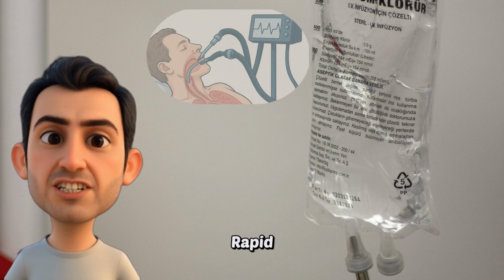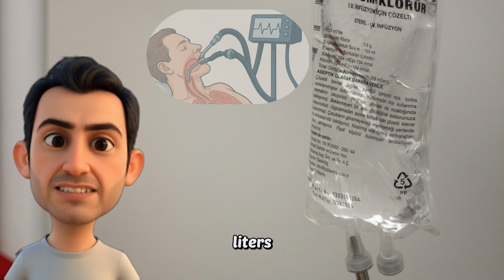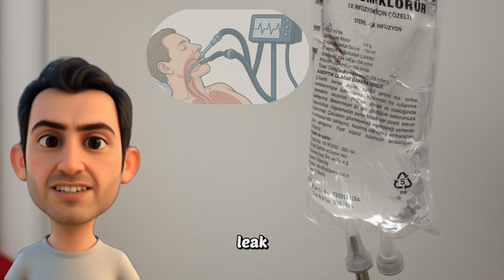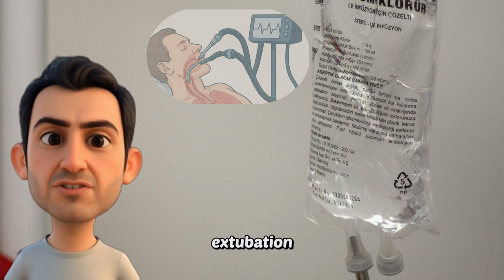Then calculate the rapid shallow breathing index. That's respiratory rate divided by tidal volume in liters. If it's under 105, extubation might be safe. Also, do a cuff leak test. If there's no leak, that airway might still be swollen, and extubation could fail.